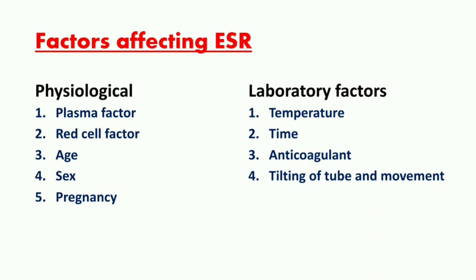There are various factors affecting ESR. They may be physiological factors or laboratory factors. Physiological factors include plasma factors, red cell factors, age, sex, and pregnancy. Laboratory factors that affect ESR are temperature, time, anticoagulant, or tilting of the tube or any movement.